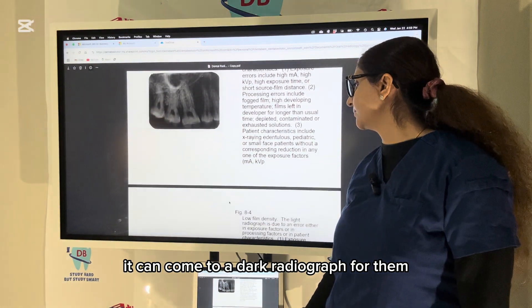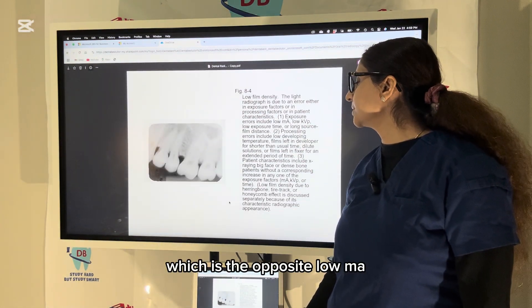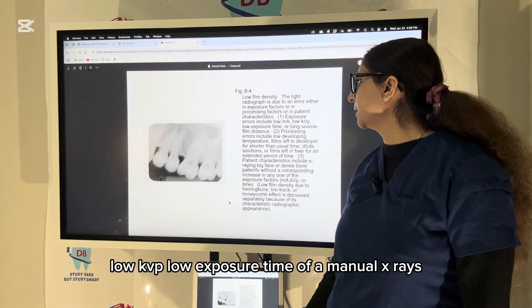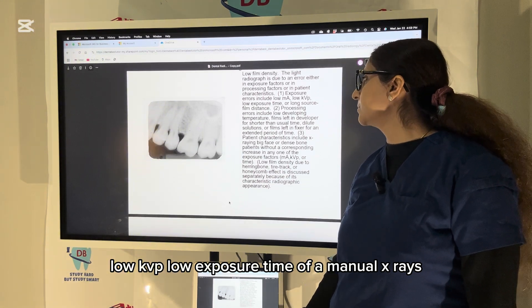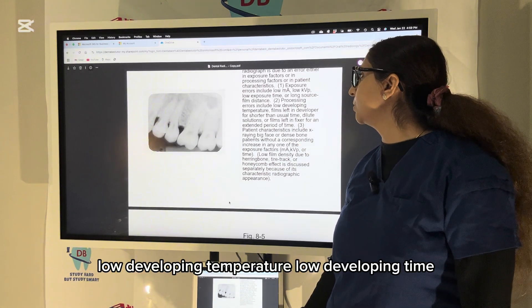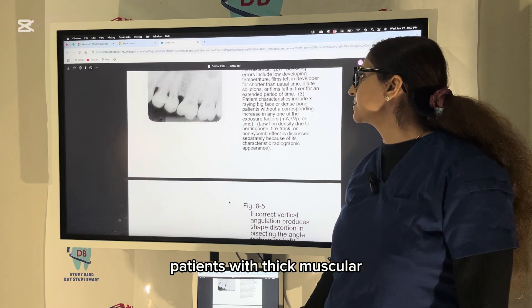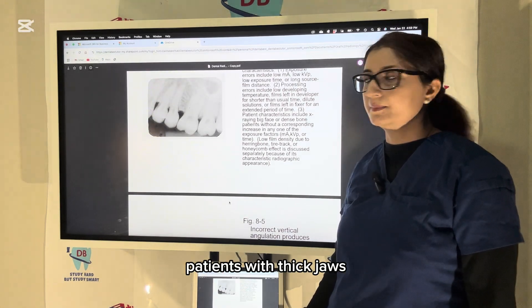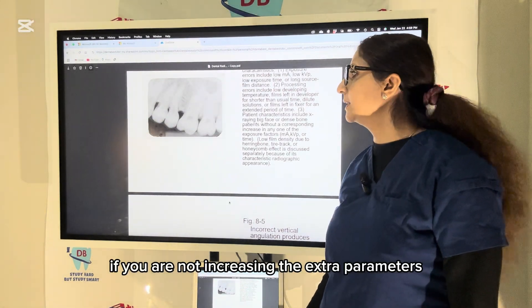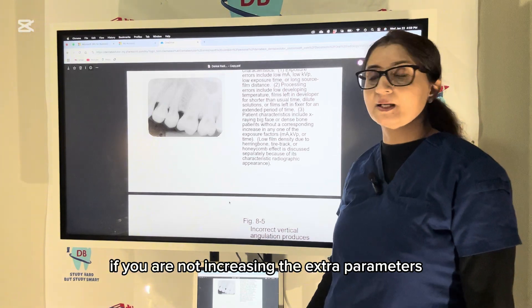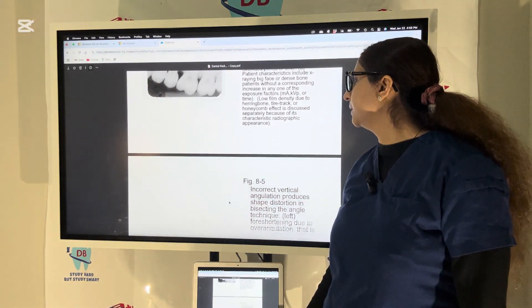This is a light radiograph — just the opposite: low mA, low kVp, low exposure time, low developing temperature, and low developing time in manual X-rays. For patients with thick musculature or thick jaws, if you do not increase the X-ray parameters it can result in a light radiograph with low film density.